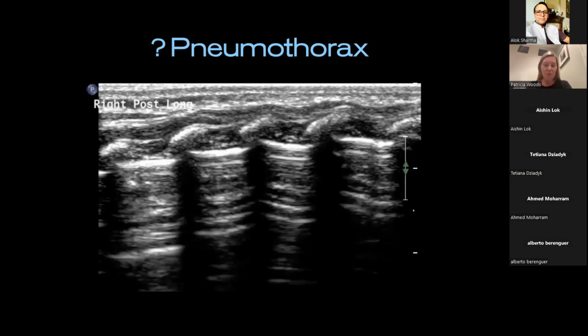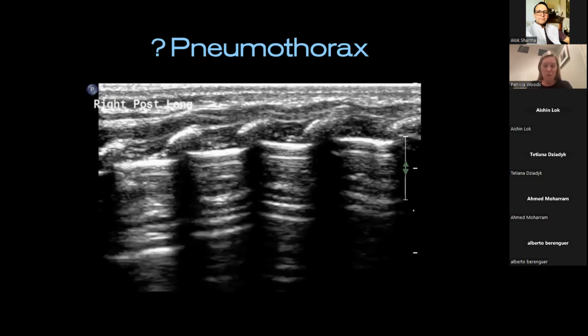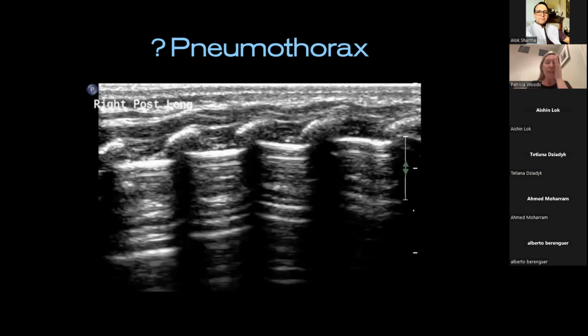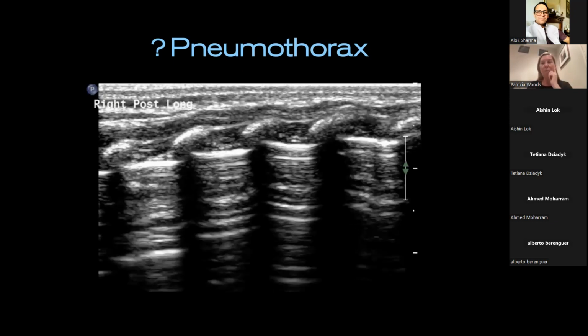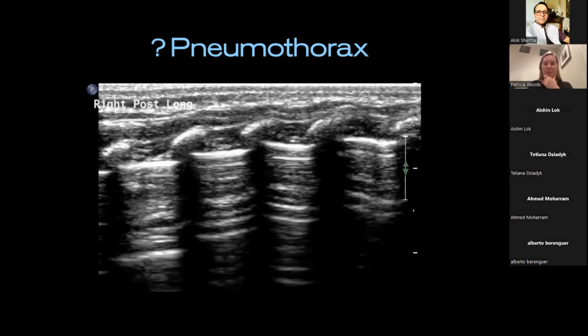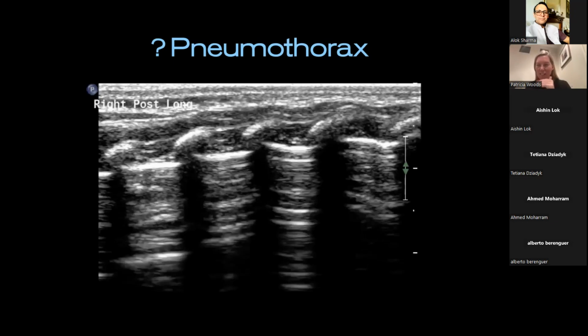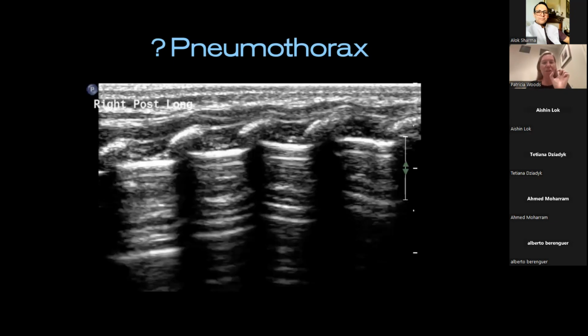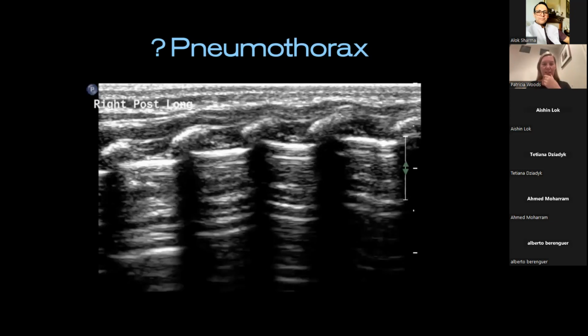But again, go through it. Horizontal sliding, really not sure. I would need B mode, M mode here. I'd really need to go hunting for lung point and really think in this area, if what, so what. So it's not crystal clear always. You might stare at the screen for ages, put on your M mode, and it's grainy. It might just be so subtle and hyperinflated.